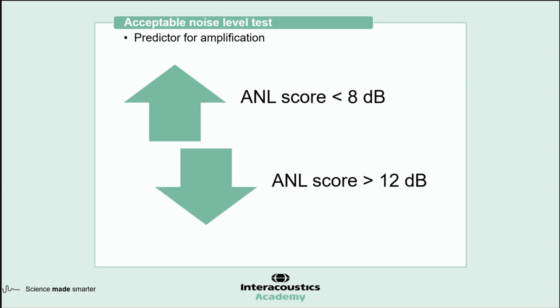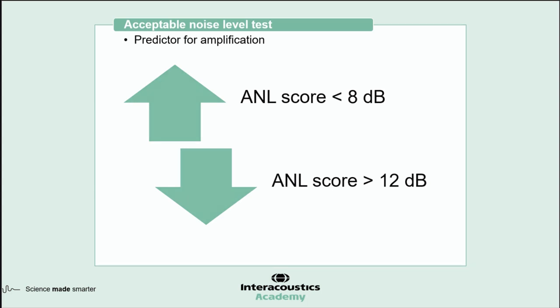This test can go really, really nicely hand in hand with speech intelligibility scores. And again, in the Tests Beyond the Audiogram webinar, there's a really nice demonstration of how the two go hand in hand with some indications as to who is going to manage well, who is going to struggle. And this information can guide where you set up noise reduction algorithms on the hearing aid, whether you need to consider assistive listening devices, whether a hearing aid is appropriate or not for that particular person. So it can really guide a lot of where you then progress down the rehabilitation route with that particular patient.